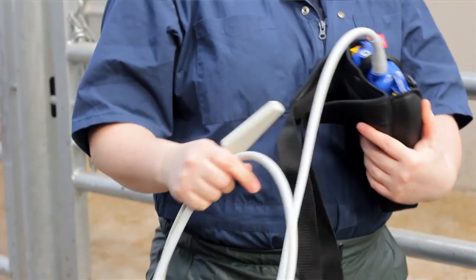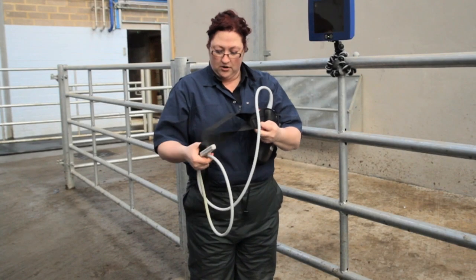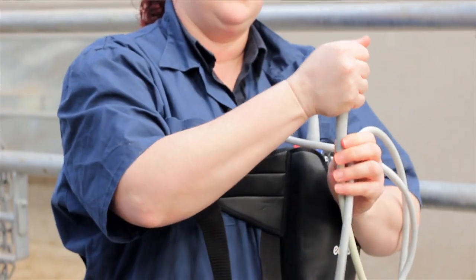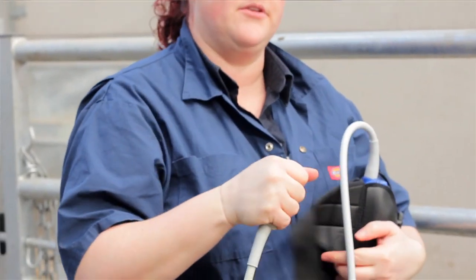Let me clip that in. Next, we'll go ahead and put the scanner on and then make some adjustments. Just as a note, remember to always hold the face of the probe in the palm of your hand so it doesn't knock against any gates and become damaged.